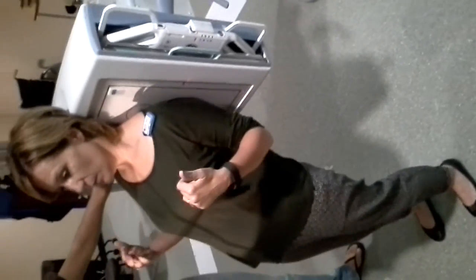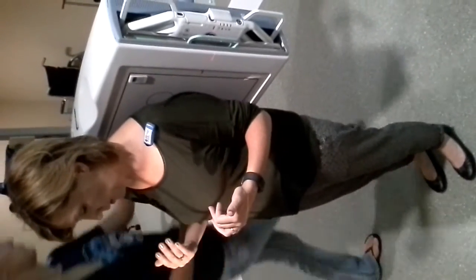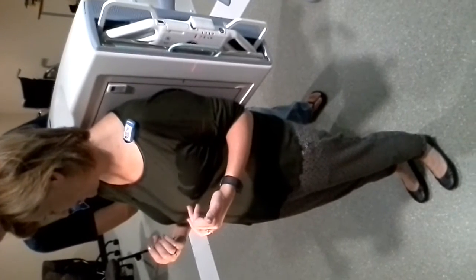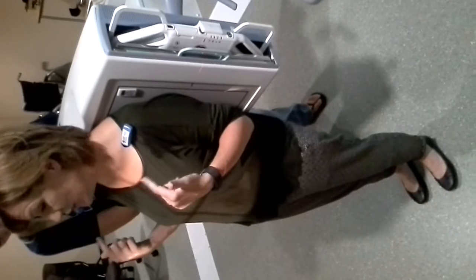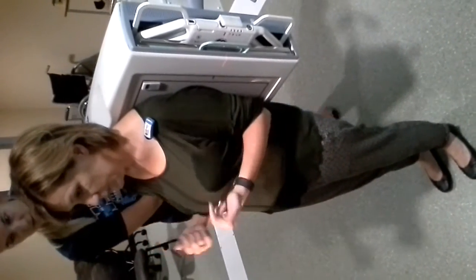Yeah. Okay, so then if you wanted to adjust it, I'd probably tell my patient to stand up and maybe just lower it a little bit more. Am I telling you the right way? Yeah, you would lower it, right? Lower it, yeah, because it was too much. It was too high, right? Yeah. Think more, guys? Or? I think that's good. Yeah, that should be good.